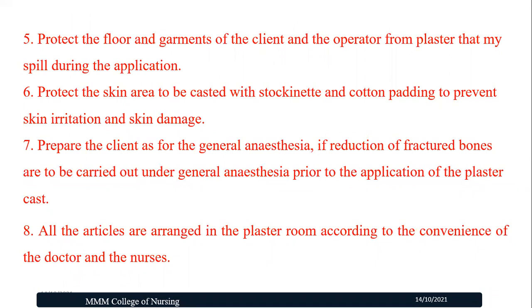Protect the floor and garments of the client and the operator from plaster that may spill during the application. Protect the skin area to be casted with the stockinette and cotton padding to prevent skin irritation and skin damage. Prepare the client for general anesthesia if reduction of fractured bones is to be carried out under general anesthesia prior to the application of the POP. Sometimes the physician may perform the closed reduction of the fractured area before application of the POP. In that case, we have to prepare the patient for general anesthesia.